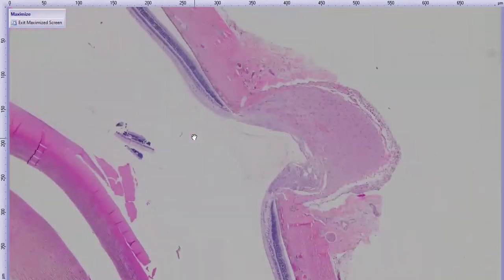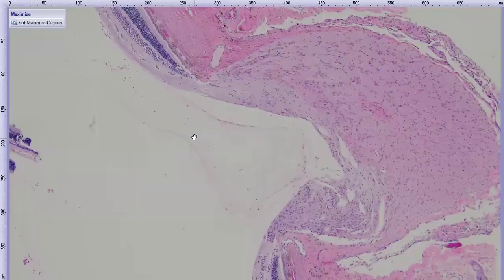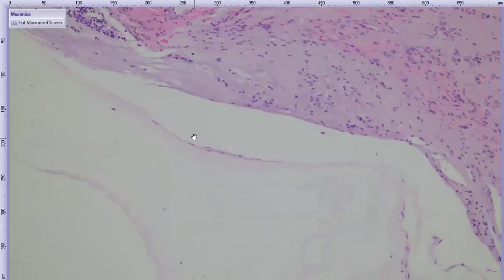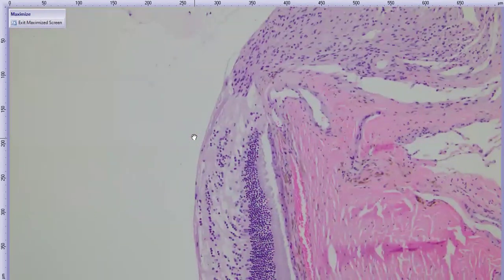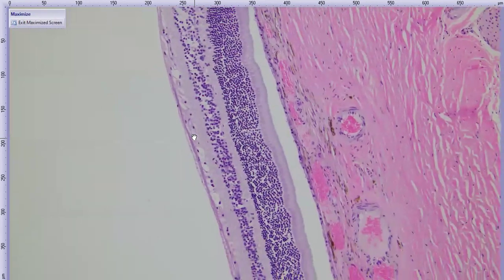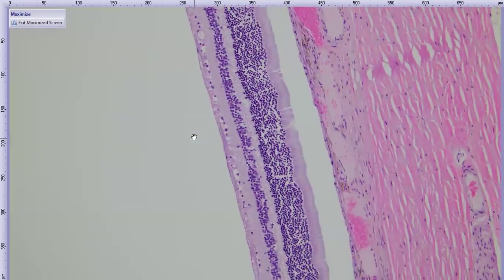And then again, surprising since they said no glaucoma, and we don't often see this large cupping in cats, even when there is glaucoma. And so there's a big atrophy and loss there. And we can see that there's no retinal ganglion cells here either, which is a little bit more common with feline glaucoma.